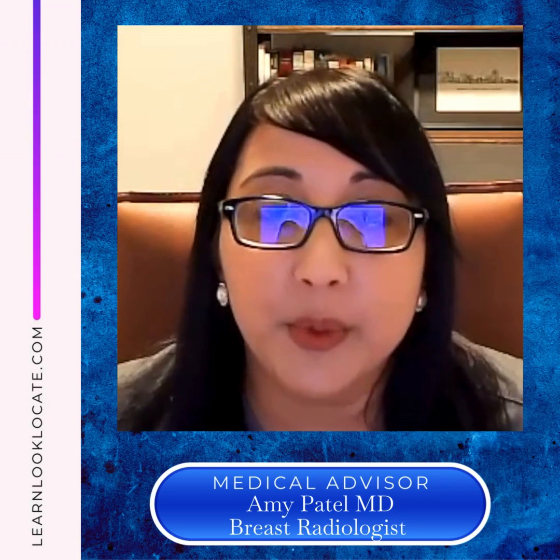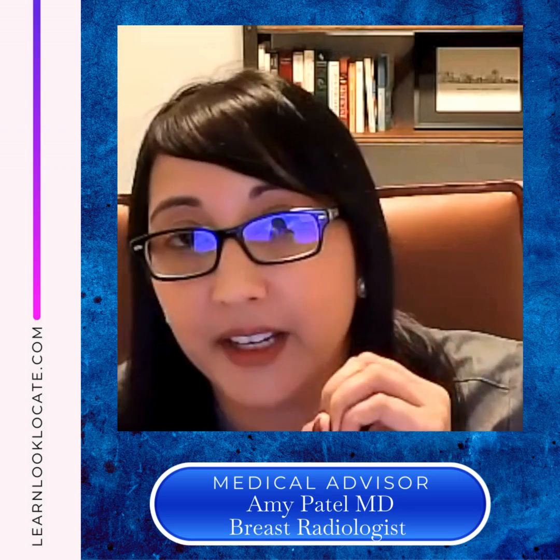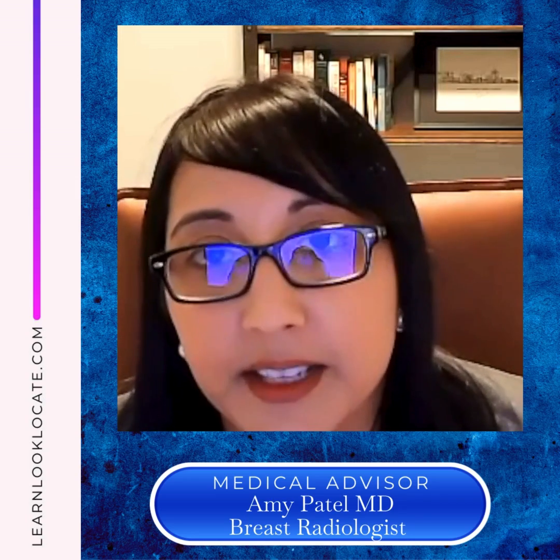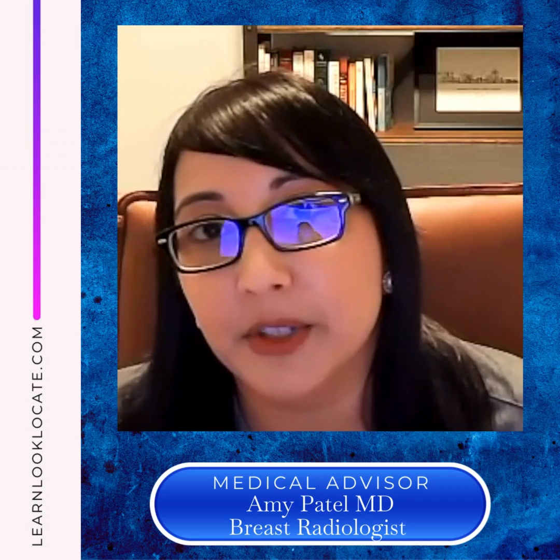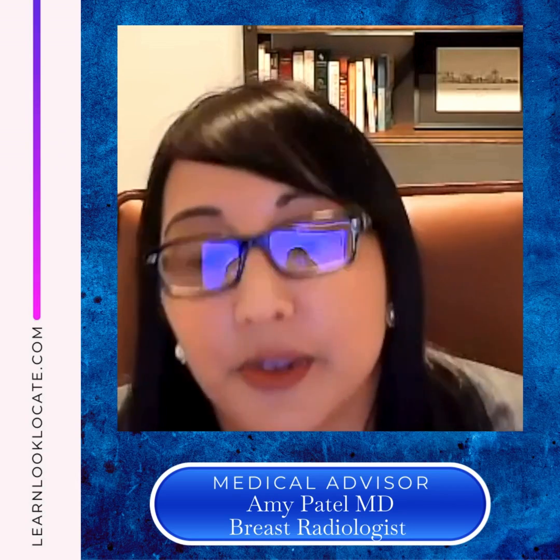On a mammogram, we look for anywhere from maybe a mass that looks like a ball that's more convex, but we can also look for areas of asymmetric tissue. There are multiple different entities of what are called an asymmetry of the breast. And why do we care about asymmetry? Because in breast imaging we are all about something called pattern recognition.